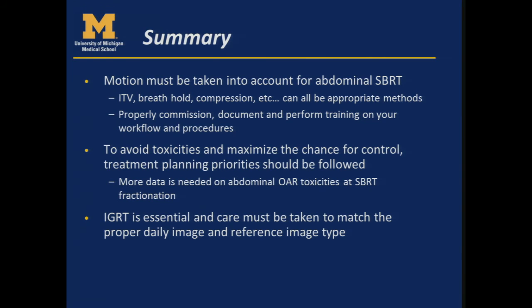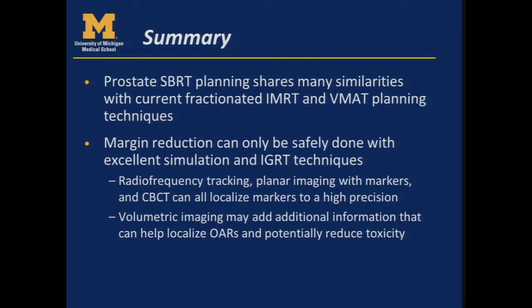IGRT is really important, and you want to make sure you're pairing up the right image of the day with the right reference image. And prostate SBRT planning, of course, we think shares many similarities with current fractionated techniques, and that margin reduction can be done safely, but only with really good IGRT and simulation and immobilization techniques.